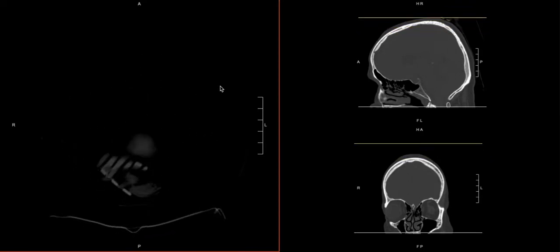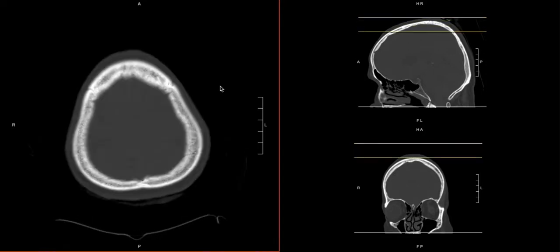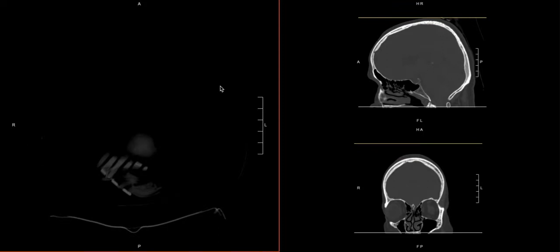We'll stick to the big picture concepts, and then we may have other videos that go over some of the other anatomy. But the bottom line is that you need a very systematic approach to make sure you don't miss any fractures, because some of these fractures are going to dictate management significantly. So it's important to be thorough and to look at everything systematically if you can.